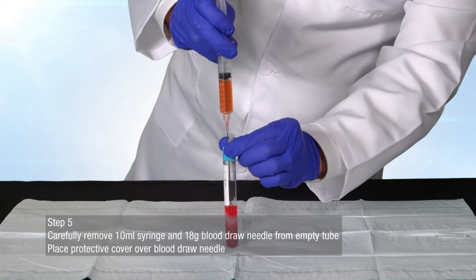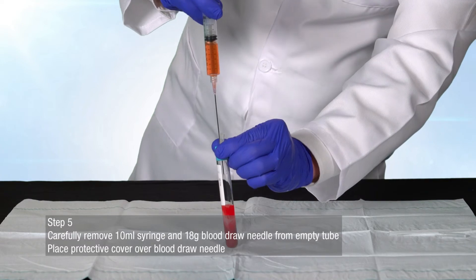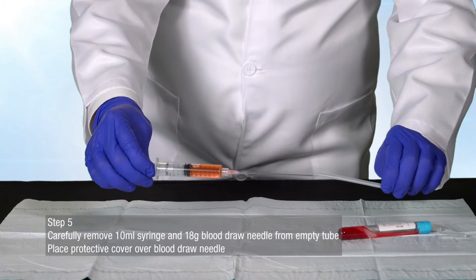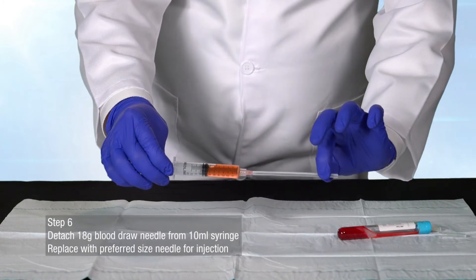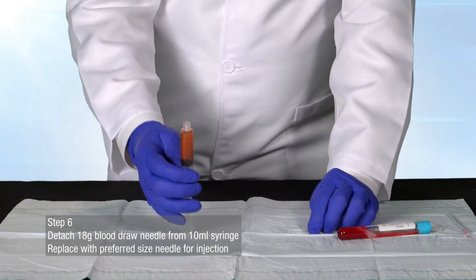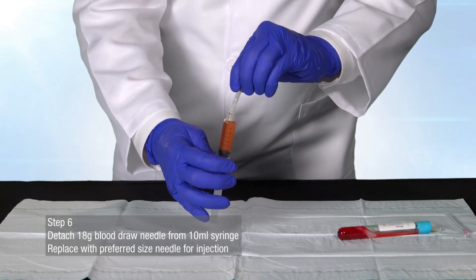Carefully remove the 10 milliliter syringe and 18 gauge blood-drawn needle from the empty tube and place a protective cover over the blood-drawn needle. Detach the 18 gauge blood-drawn needle from the 10 milliliter syringe and replace with preferred size needle for injection.